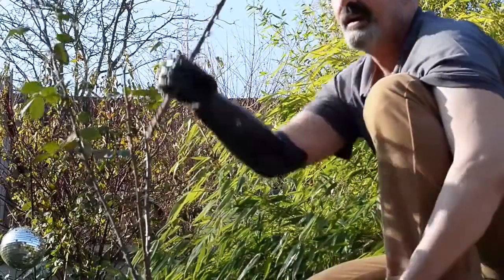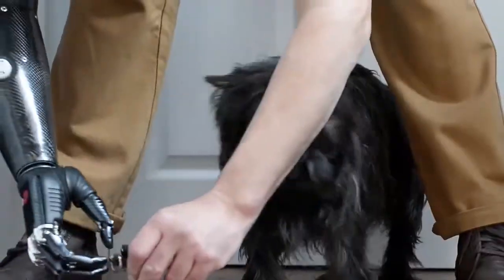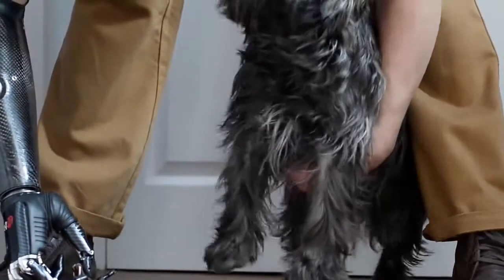It does make life a lot easier — things like tying laces, getting dressed in the morning, making a drink, taking the dog for a walk. It makes life an awful lot easier with two hands.